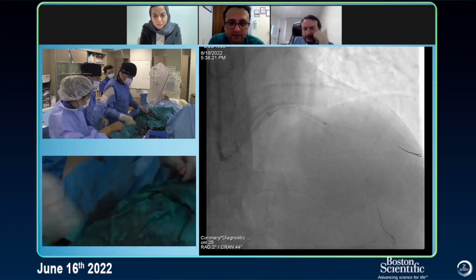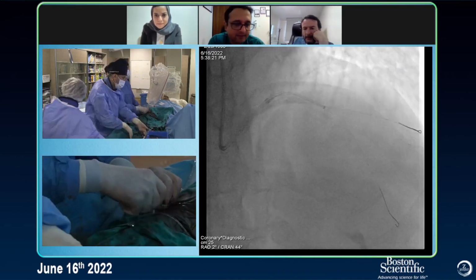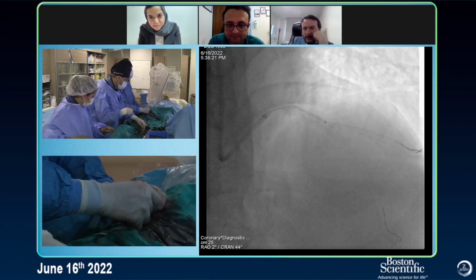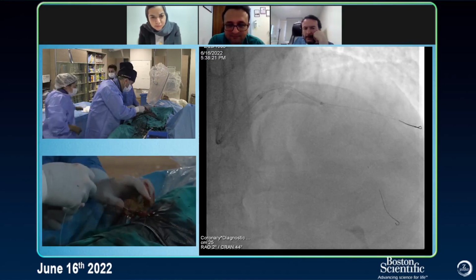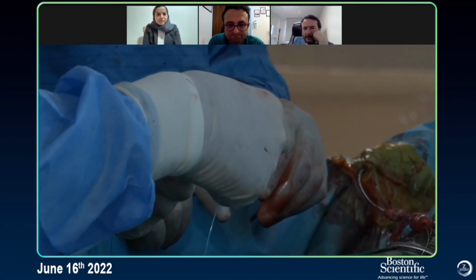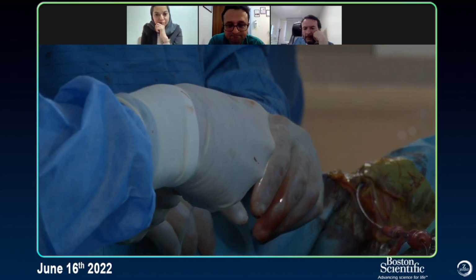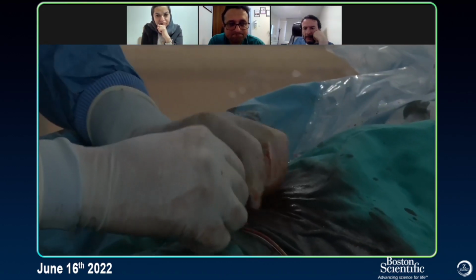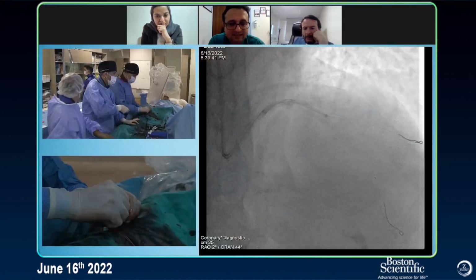Oh, great. So we've got the guideliner. Now I'll do cloth, guys, here. Cloth, okay?